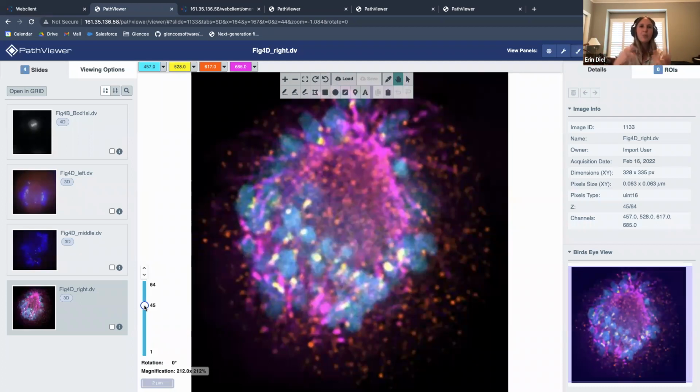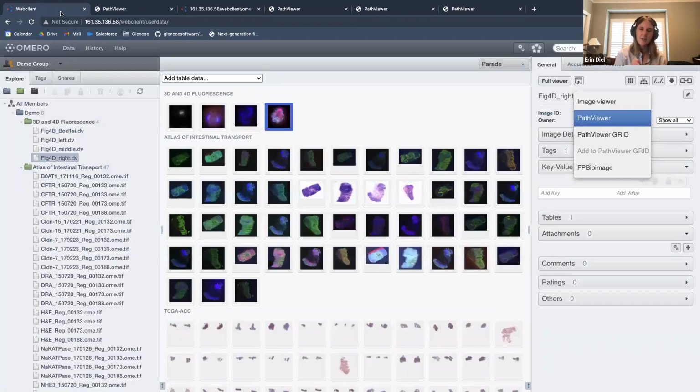And so I just wanted to briefly mention that 3D data and time-based data is completely compatible with OMERO, and you'll find plane-based viewers with sliders. But if you really want that 3D rendering view, you'd want to connect to some of these other applications that have proper volume viewers. It's not necessarily a focus of a lot of OMERO viewers, to be perfectly honest.